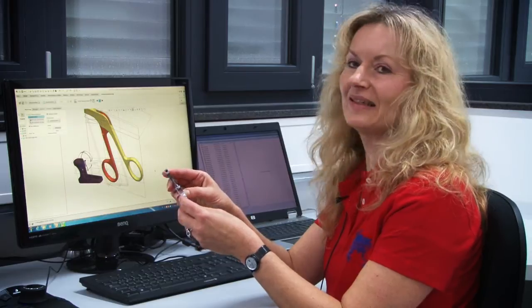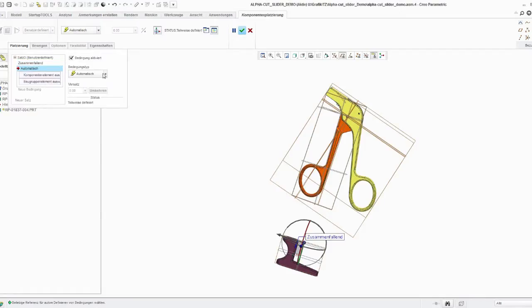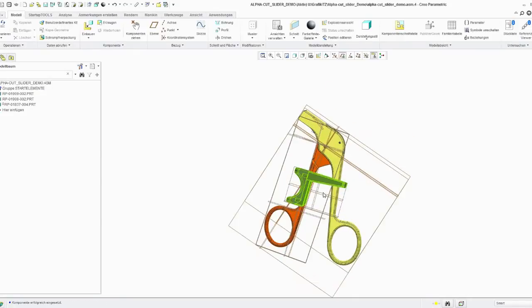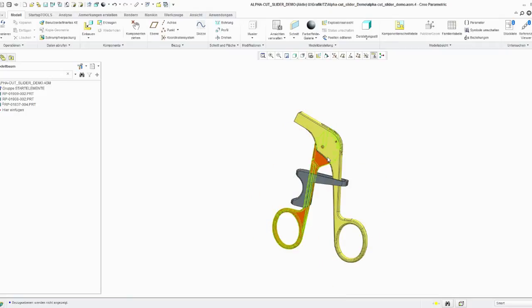My name is Gerlinde Kleiber. I am an engineer and my job is to fix this slider on this handle with the help of Creo. It is really easy to build it with Creo. Here I can define different conditions — for example, that this part has to be parallel to this level. I can easily place this part in the right position; here I can define the distance, or if it should be parallel, or have an angle. And easily, the slider is fixed.